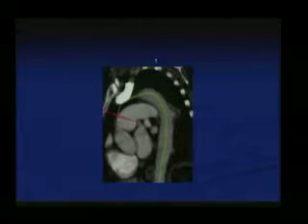So these are some of the images. This is the small penetrating aortic ulcer. This is definitely a large one with some hematoma around it. An axial CT scan. Reformat image. This is the center line, penetrating aortic ulcer, proximal and distal. So this is way beyond the subclavian, so we're not concerned about that.